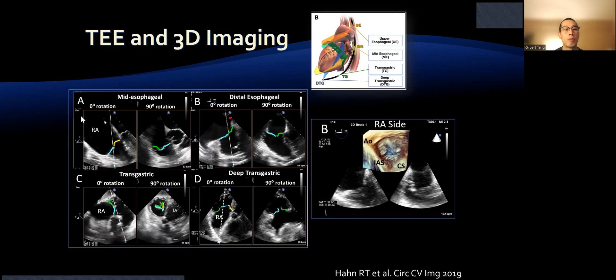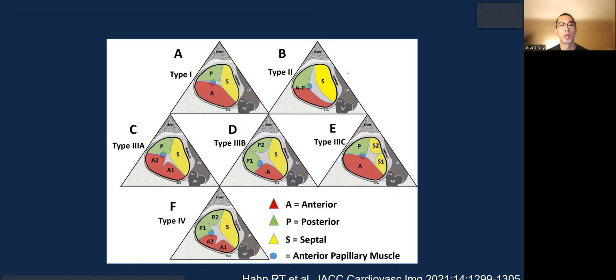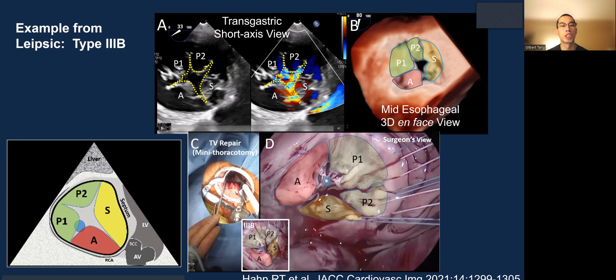In terms of the mid-esophageal view, there is also a new nomenclature proposed for classifying the tricuspid valve based on the number of leaflets present. The most common type is type 1, which is a 3-leaflet valve, but the second most common is type 3B with two posterior leaflets — a quadricuspid valve.